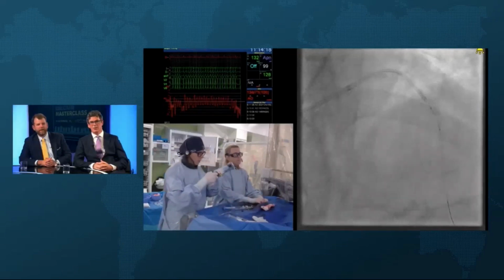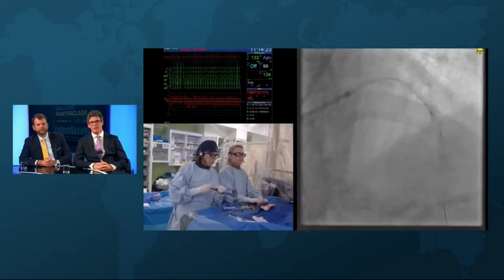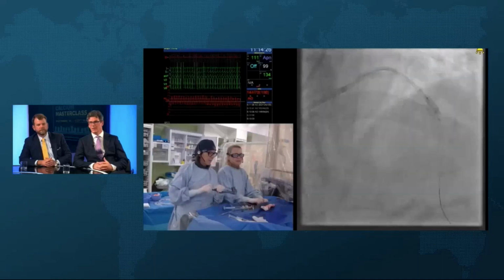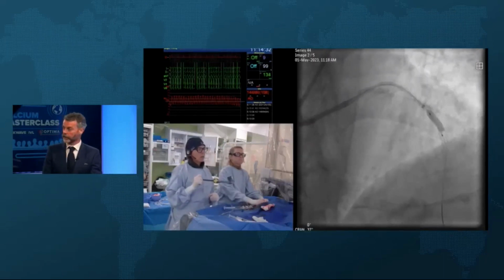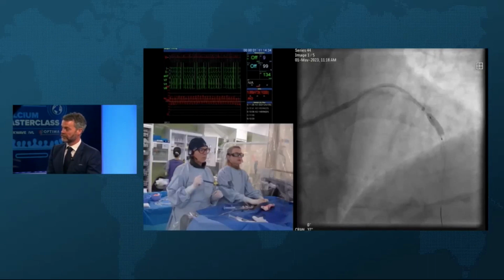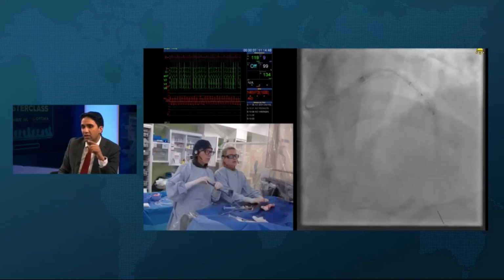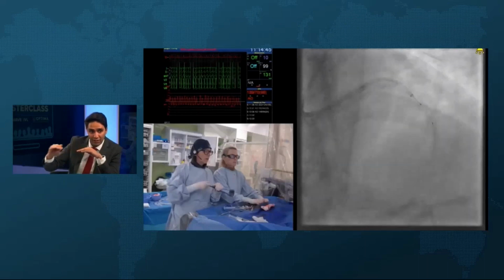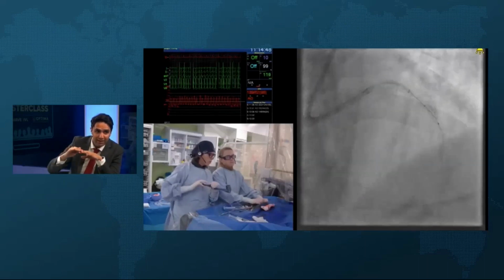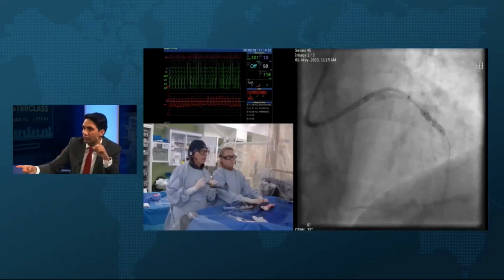Yeah, we did that deliberately, Jonathan. It's lovely delivery. But it's very difficult to understand the exact length in the absence of co-registration, which is a big weakness in the Boston IVUS at the moment. That's coming though, I hope. Yeah, it's coming. The other thing is, this is an important point when you're doing long segments of IVUS. The artery slides over the IVUS catheter, so it's like taking 2 steps forward and 2 inches back. And so you will tend to elongate your length when you do a long IVUS run compared to a short one.